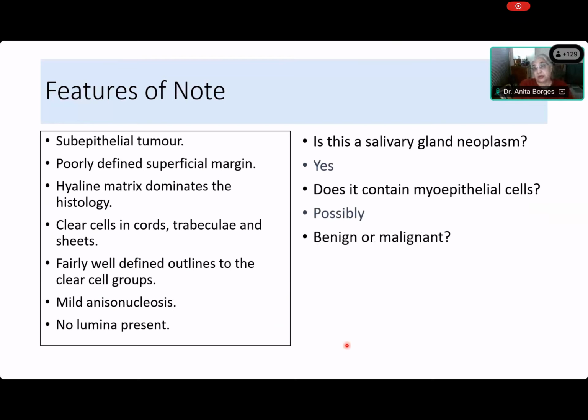And the question is, is it benign or malignant now? So what do you think? That's the next question. Yes, ma'am. If these were myoepithelial cells, would you call them benign or malignant? And if they are not myoepithelial cells, what would you say? If not myoepithelial cells, then we will consider it malignant. If they were not myoepithelial cells, you would say it is malignant. Excellent. Because the only thing that is benign and is not of myoepithelial origin is the Warthin's tumor.